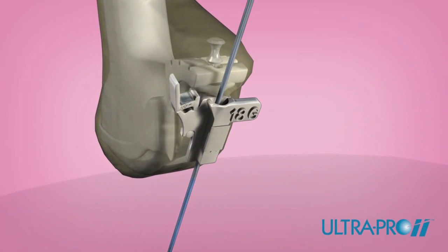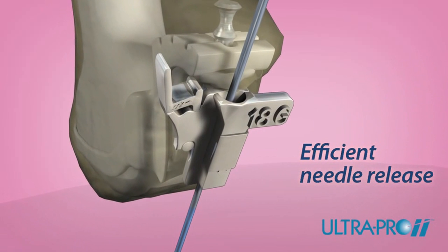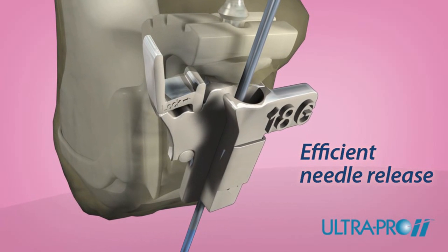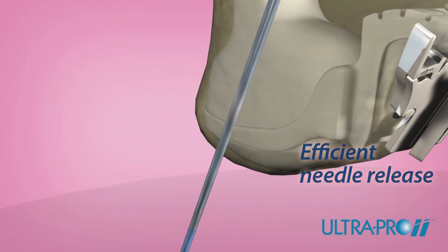Offering greater flexibility, the UltraPro 2 allows users to quickly detach the needle from the transducer during puncture procedures. To activate the quick release, simply press the large insert tab and move the transducer away from the needle or catheter.